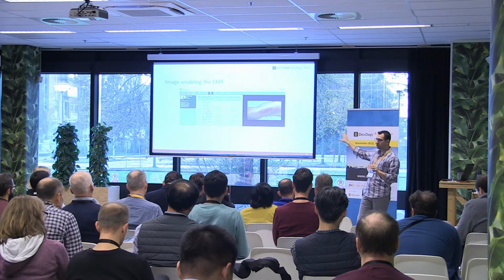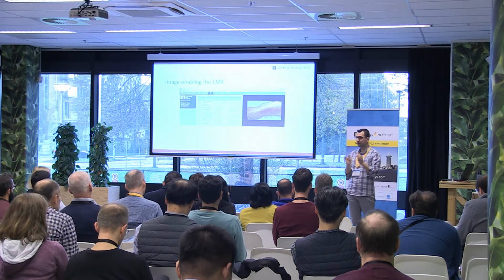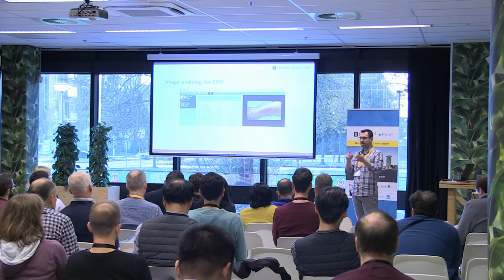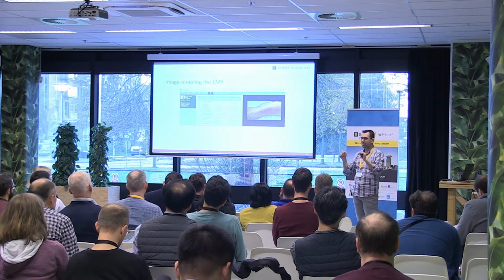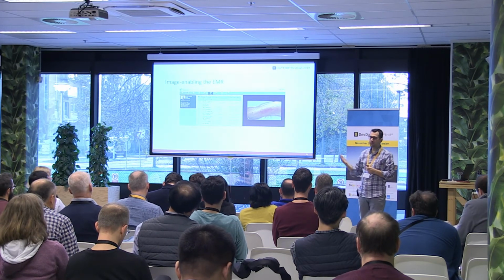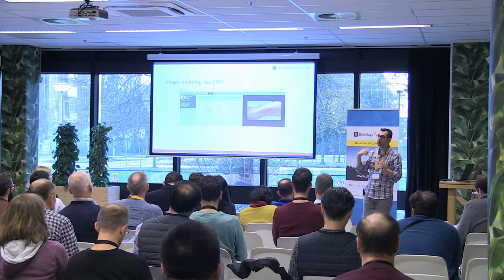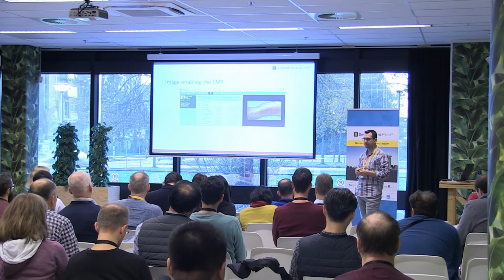It's more like if you want to show it for convenience, then yeah, go for it. But if you want to show it for any useful purpose, you want to use a proper DICOM viewer, because they need tools, they need to be able to make measurements, they need to be able to adjust contrast, brightness, and things like that to be able to make use of them. If there are multiple images, like a CAT scan, they actually need to be able to loop through them. So they don't need just one individual image at a time, okay?